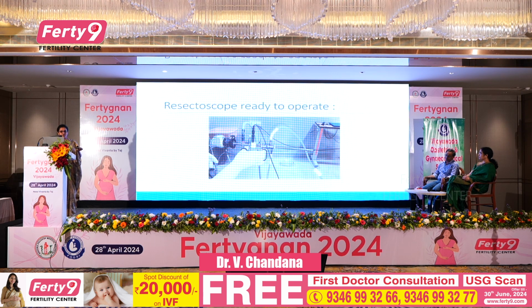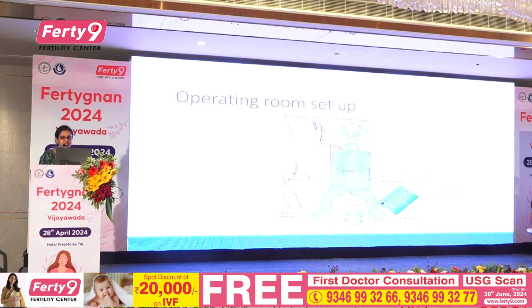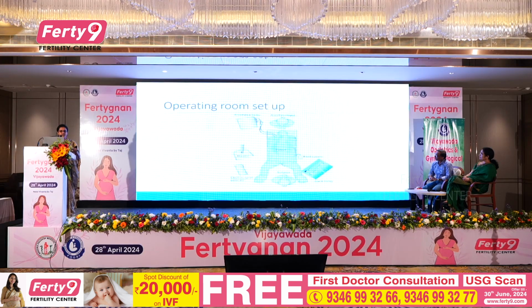This is a resectoscope which has been assembled to do the procedure. We can see here that it has an inflow tract, outflow tract and an outer sheath and a cable connected for the cautery to work. And this is an ideal operating room setup. You should be operating from the foot end of the patient, the anesthesia monitor and the anesthesiologist at the head end of the patient, and the electrosurgical unit on the right side of the patient's leg, and a monitor almost at the thigh level of the patient, and your table on the right side.